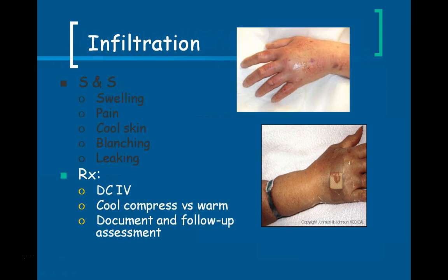So what do we do if we have an infiltration? Well, that site can't be salvaged, so we need to discontinue the IV and start a new one in another vein away from that site. And then we want to put either cool compresses or warm compresses on the site, and that depends on what type of fluid was infiltrated.